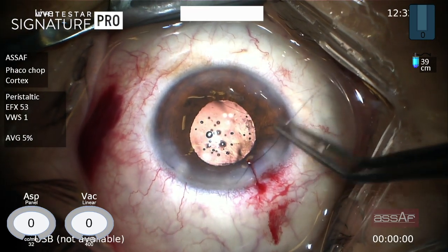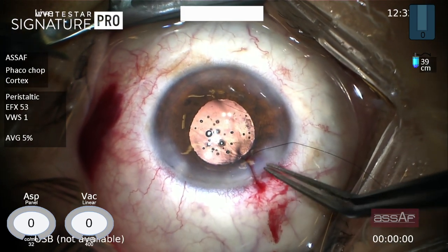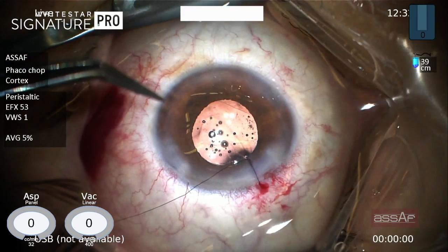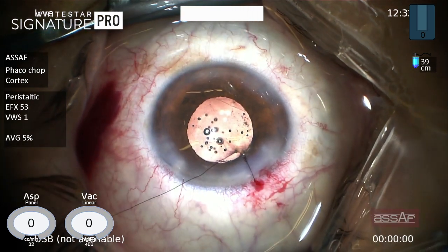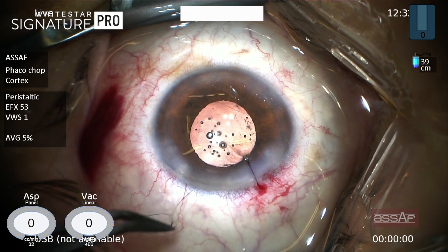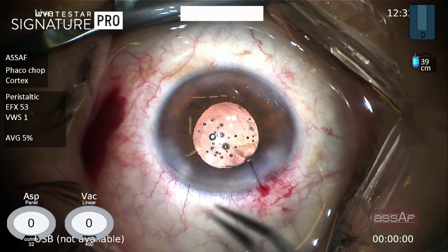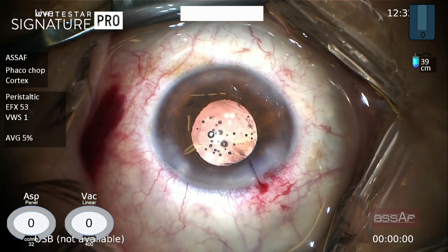So my key message here is to expect the worst to get a happy ending. Anticipate complications in any post-vitrectomy eye, especially if fluid-filled rather than silicone-filled. This eye behaves like eyes with posterior polar cataract and may end up with an open posterior capsule. Prepare a three-piece backup plan. Don't forget zonular laxity and lack of posterior segment support, which cause excessive trampolining of the posterior capsule.